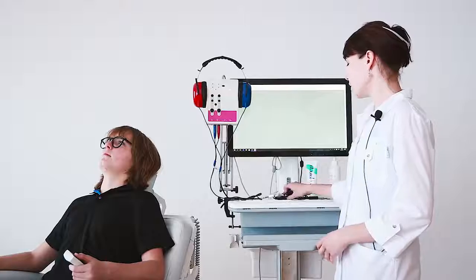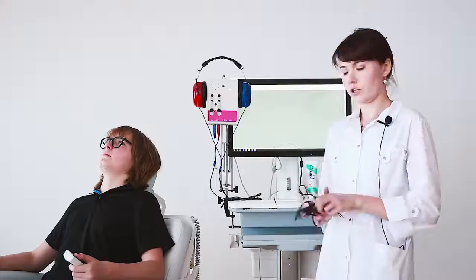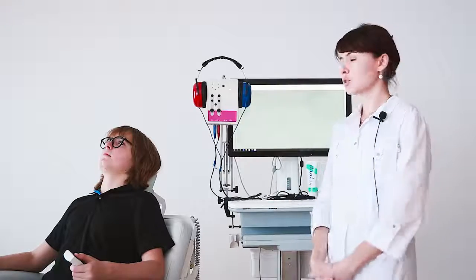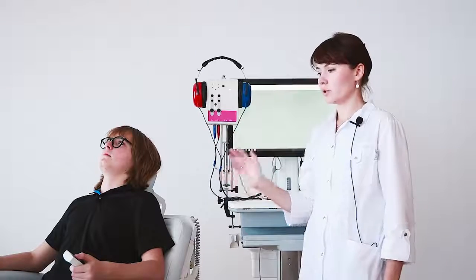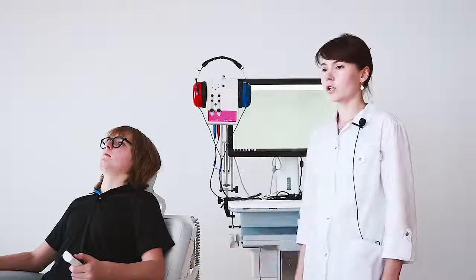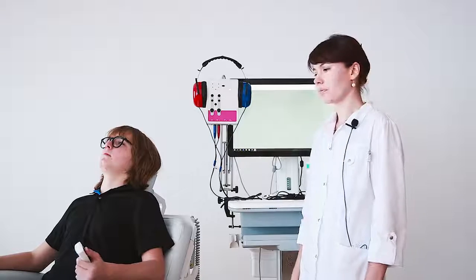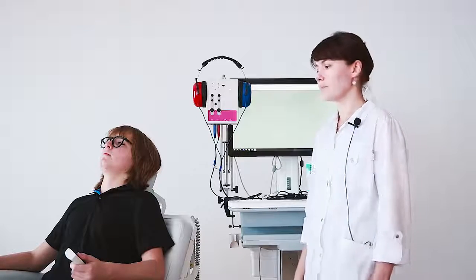For the bone conduction study, we can use a bone vibrator stimulator. Today we will use headphones. Firstly, we connect it to our amplifier, and we give a special patient's button to the patient to check. Then the patient gives the response to the stimulus. Actually, you always need to perform this test in a soundproof room.